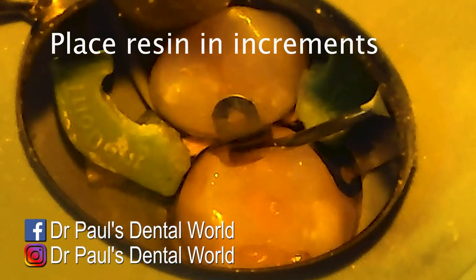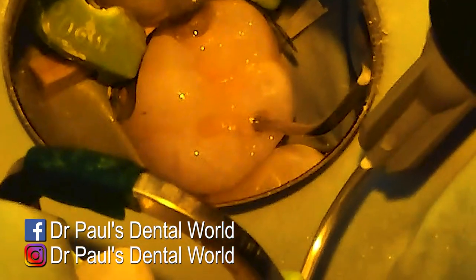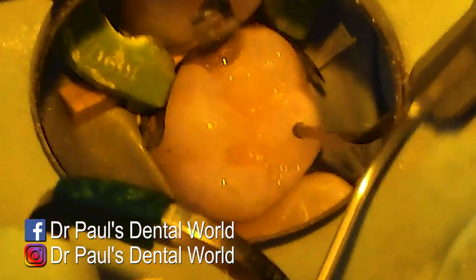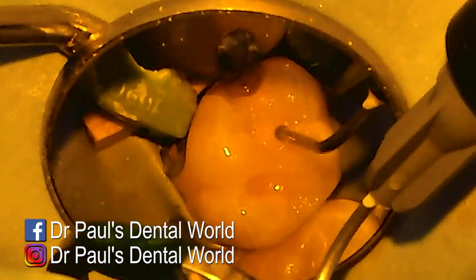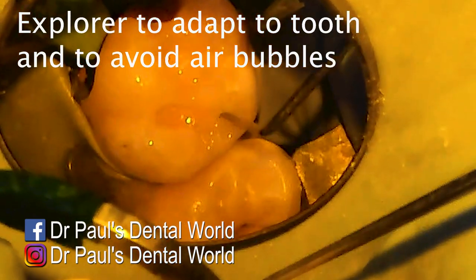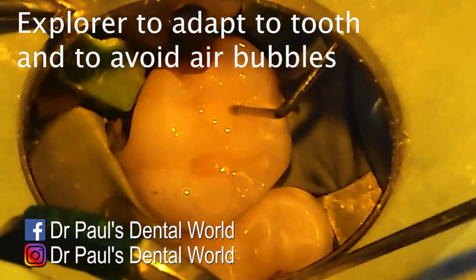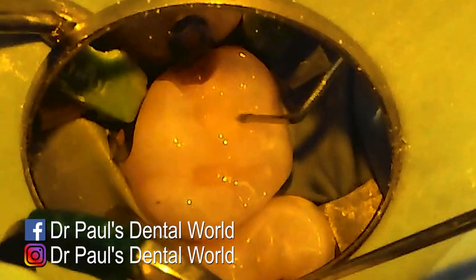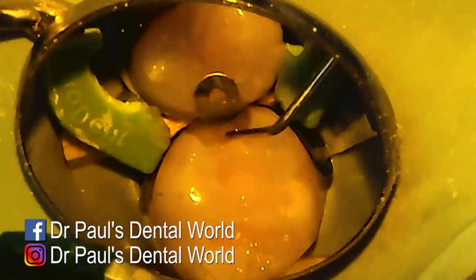The resin you have to place in increments. If you place it in one big blob, because it shrinks slightly when it sets, it will actually pull away from the walls slightly — it leads to temperature sensitivity, staining at the margins, big problems. So I place it in small increments and then use an explorer to adapt it to the walls and also make sure there aren't any air bubbles, because we are using a flowable.